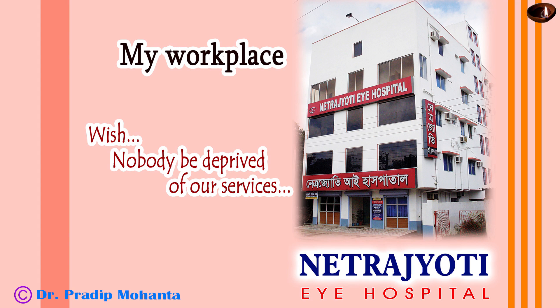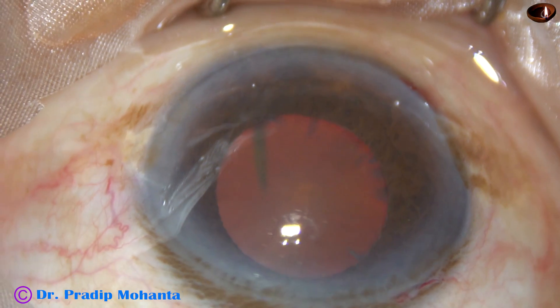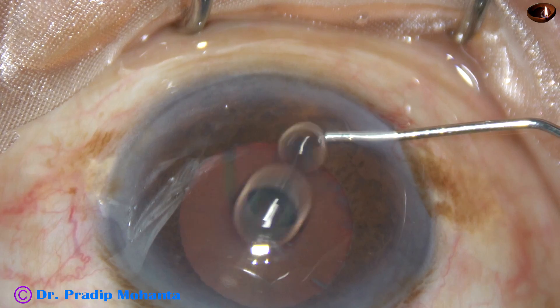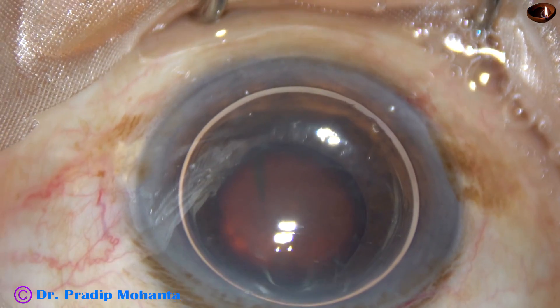Friends, welcome to my workplace at Maghat, West Bengal, India. This is a very challenging case with pseudo-exfoliation, weak zonules, a small pupil, and a hard nucleus.